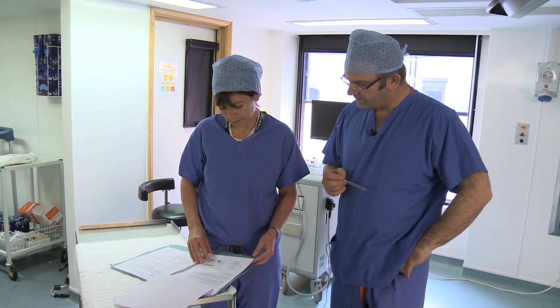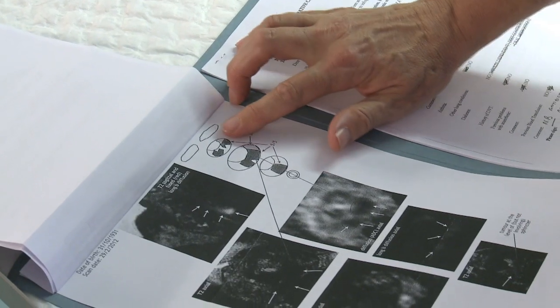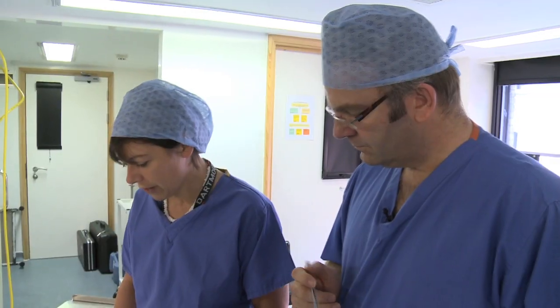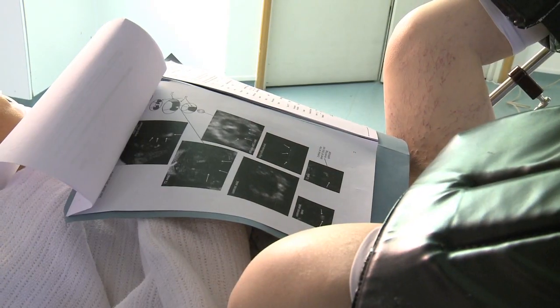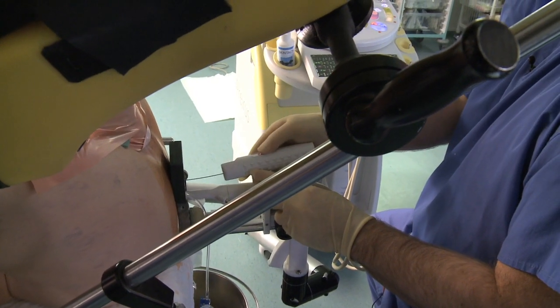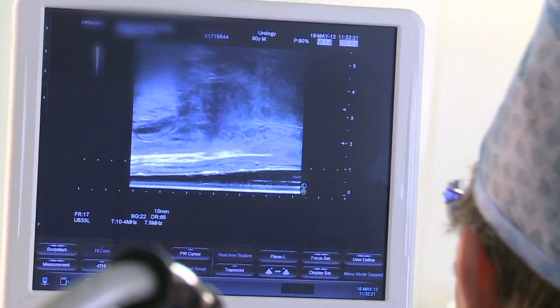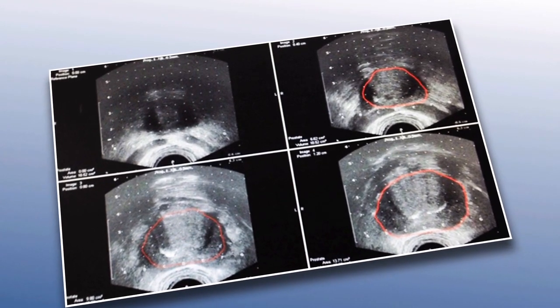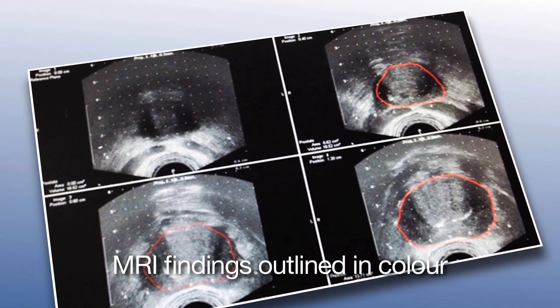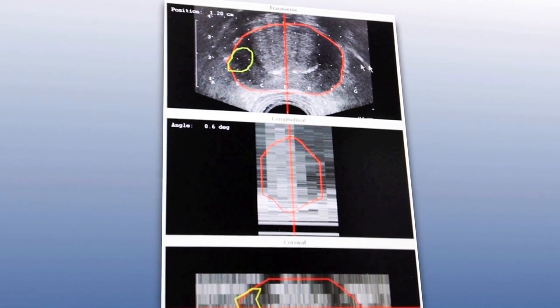If the information is in the MRI and the biopsy platform is the ultrasound, you need to somehow marry the two together. And currently, most of us, in fact most of the papers, have done it using what we call cognitive registration. The current holy grail in the prostate world is being able to match ultrasound to MR. And there are some companies now bringing out ultrasound machines that will allow us to input the MR data and to match them.